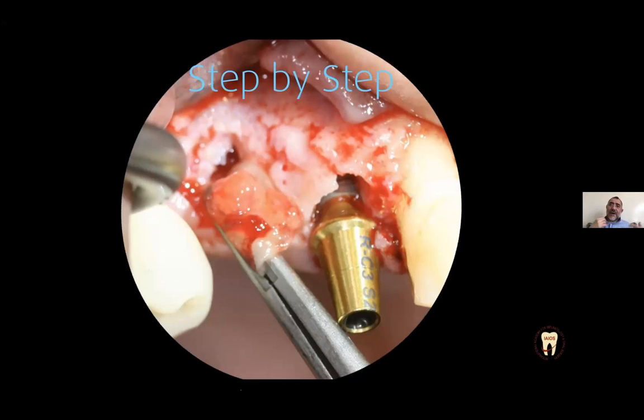And after you elevate your membrane, you can control whether you have perforated your Schneiderian membrane or not with the Valsalva technique. When you do the Valsalva technique, you see through the hole that the Schneiderian membrane is in movement. And sometimes you hear your patient say to you, "Oh, doctor, I have some water in my throat." In this moment, you know you have perforated your Schneiderian membrane.